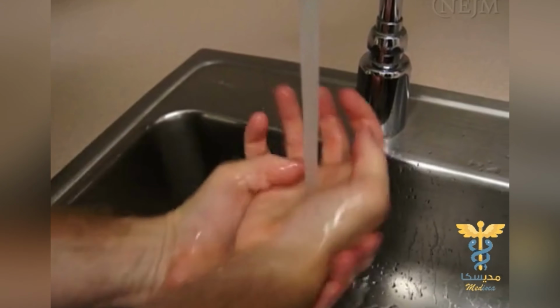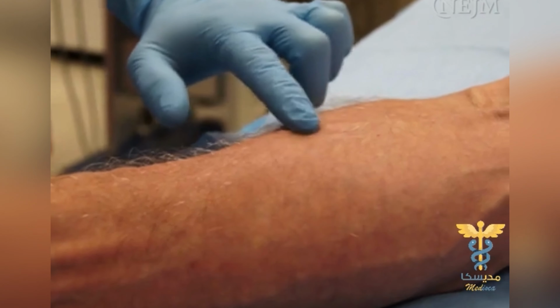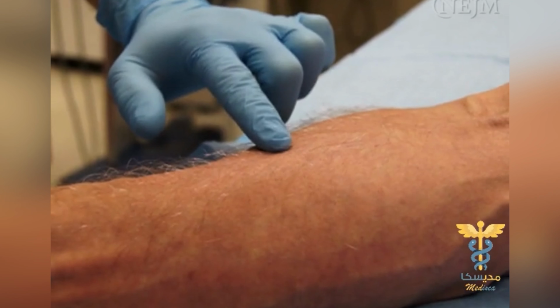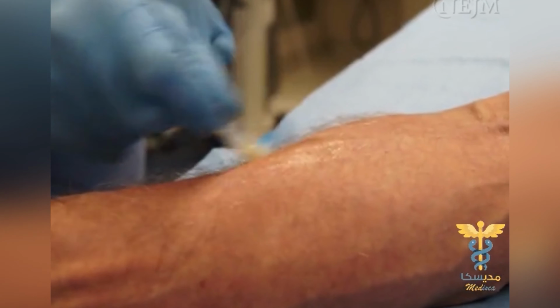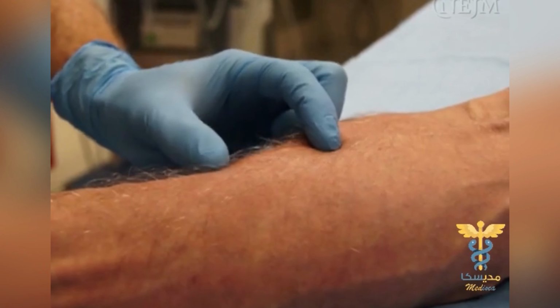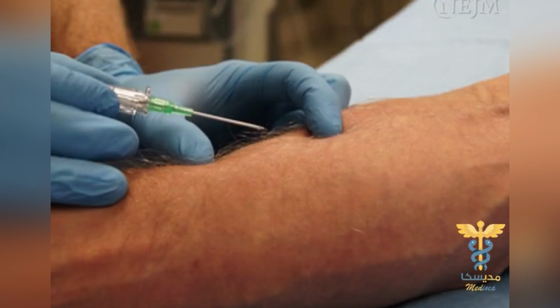Wash your hands and use universal precautions. Apply the tourniquet. Palpate or visualize the vein. Vein should be soft, elastic, and resilient, and should be pulseless. Clean the skin with the antiseptic swab. Stabilize the vein with the fingertips of your non-dominant hand. Hold the needle with your dominant hand between your thumb and index finger. Make sure the bevel is pointed up.